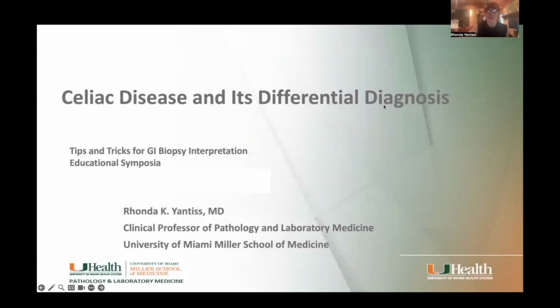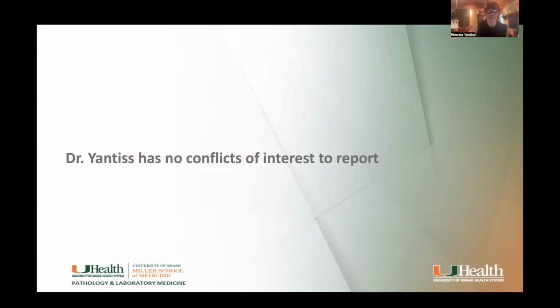Hello, my name is Rhonda Yantiss, and in this presentation, I'll be talking about small bowel biopsy interpretation with an emphasis on celiac disease and its differential diagnosis. I have no disclosures to report.